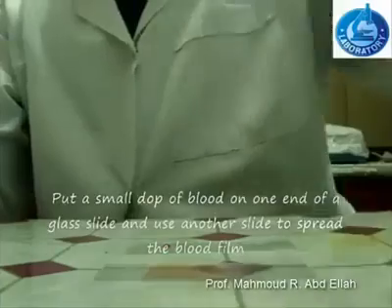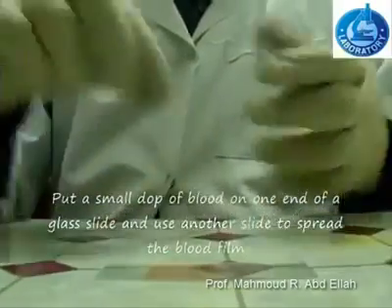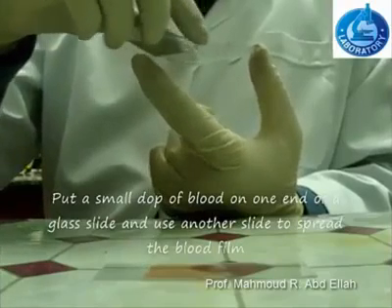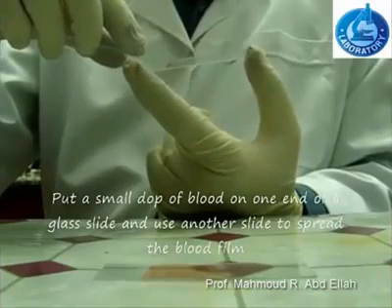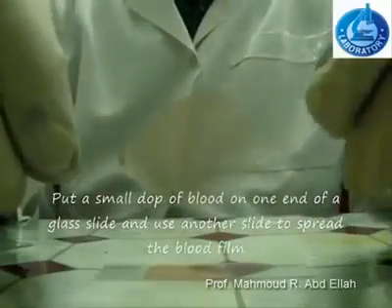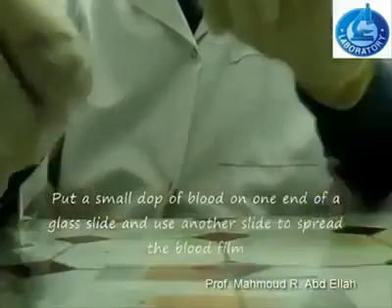Put a small drop of blood on one end of a glass slide and use another slide to spread the blood film. One end of the blood film is thin and feathered, and the second end is thick.